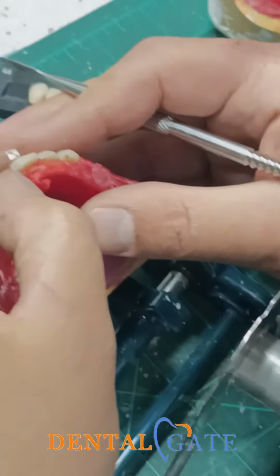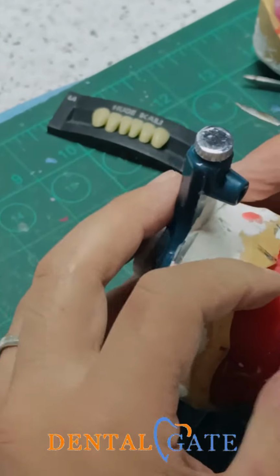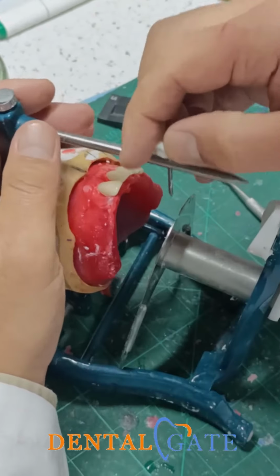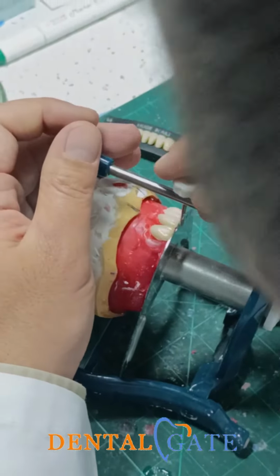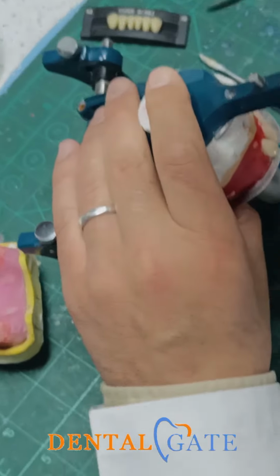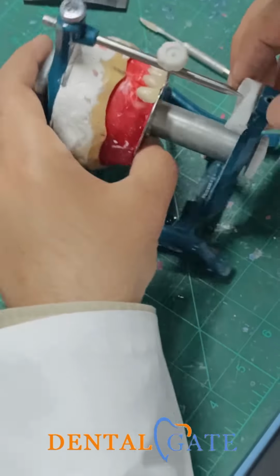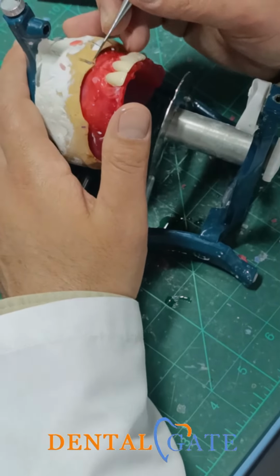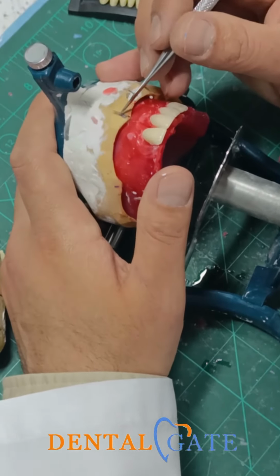So this is my midline now. You can make a check to the incisive pin. Regarding the bite, I will make my midline at a point, since there's no patient, there's no reference.